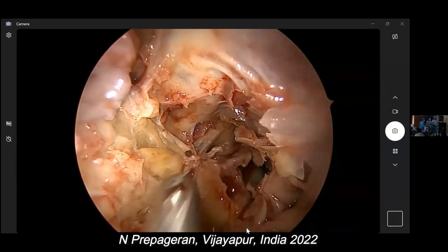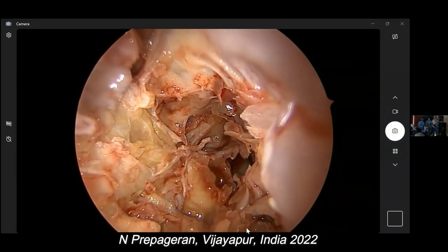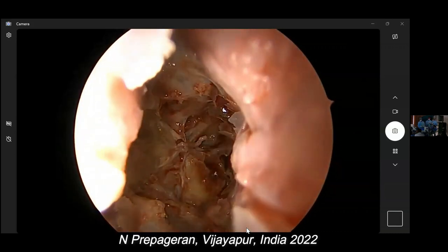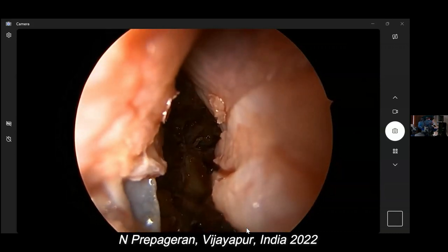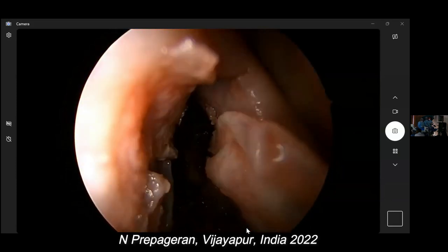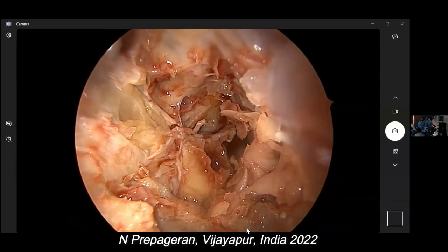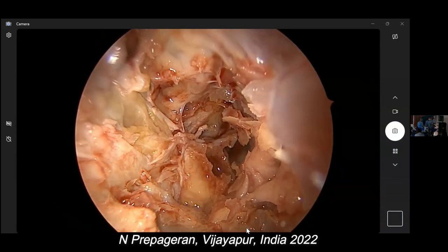Sir, are you using navigation? Because it is working, connected, okay? The navigation is not. They tried three times, but because the skin is too thick, it's not connecting. Yes, sir. So maybe we can try it for the posterior skull. They tried a few times just now. Sickle knife. You can try again if you want.